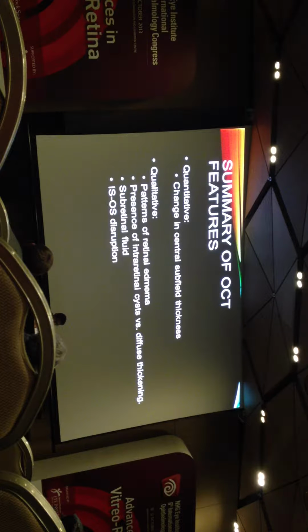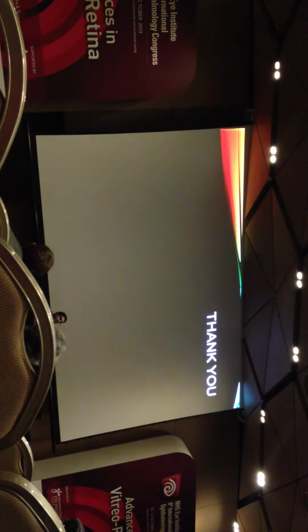So to summarize the OCT features for retinal vascular diseases, I think the quantitative changes do play a role, but you must take that with a pinch of salt and know what you're looking at. And for qualitative features, you would want to look at the patterns of edema, the presence or absence of cysts or diffuse thickening, whether there is subretinal fluid, and the IS-OS has also been shown to be of importance in evaluating outcomes for these patients. Thank you.